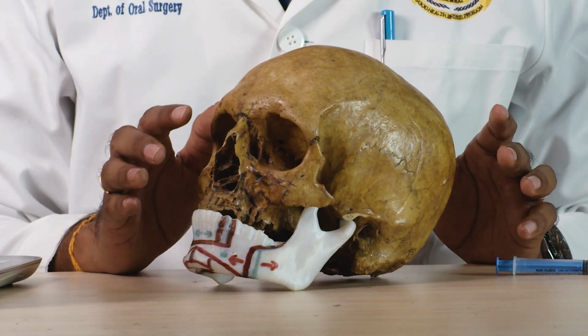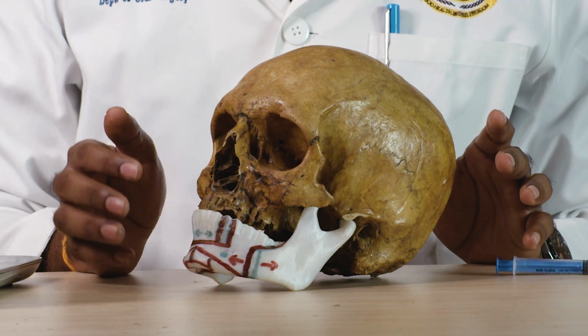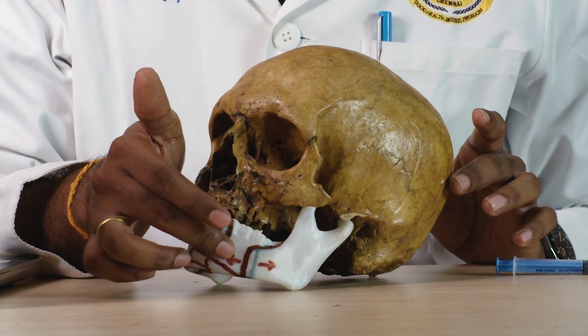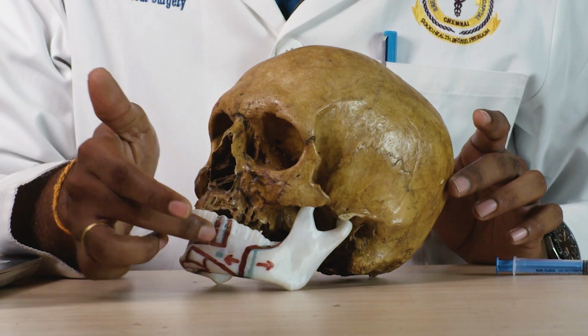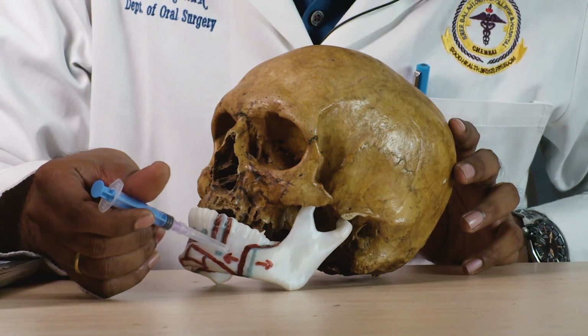The difference lying in incisive nerve block is almost the same, with an extra step being application of pressure either intraorally or extraorally for about 1 to 2 minutes over the site of injection to facilitate the diffusion of local anesthetic solution inside the mental foramen.